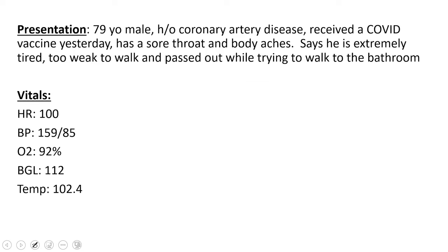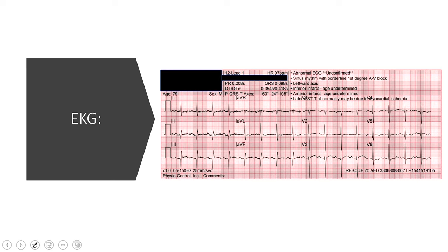Get a set of vitals like we always do. They look good. He's mildly tachy with a good blood pressure, 159 over 85, sating 92. His blood sugar is normal, but he is febrile at 102.4. So you go ahead and get a 12-lead because he's feeling so weak, and this is what you see.